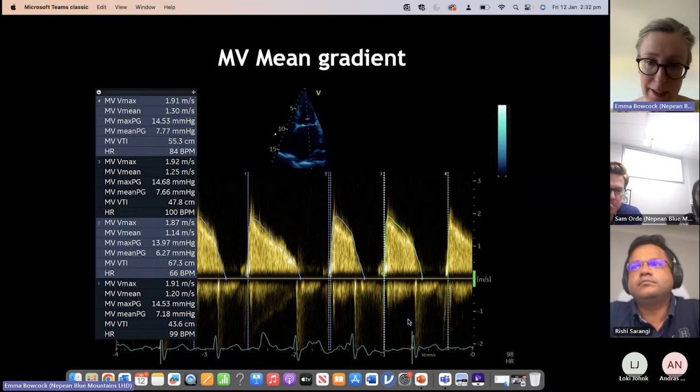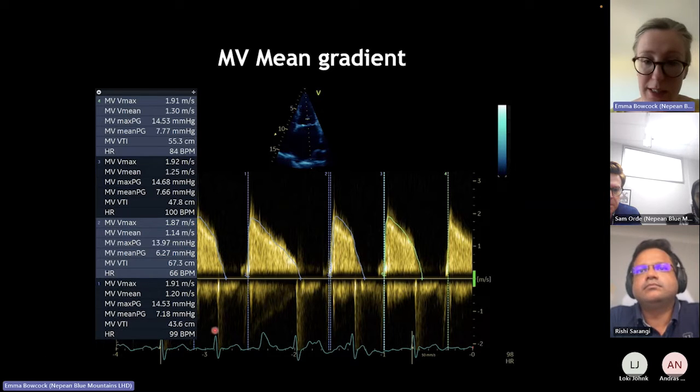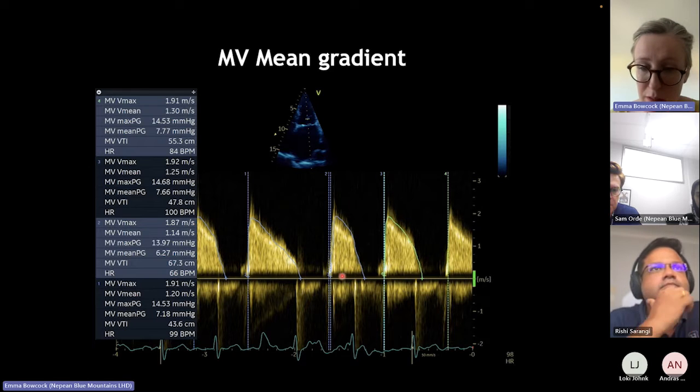But generally, the usual principles, right? So bringing this baseline down would be a way to optimize it. Bringing the baseline down, because you're interested in what's going through above the baseline here, aren't you? You see how you've got this black sort of ghosting here.